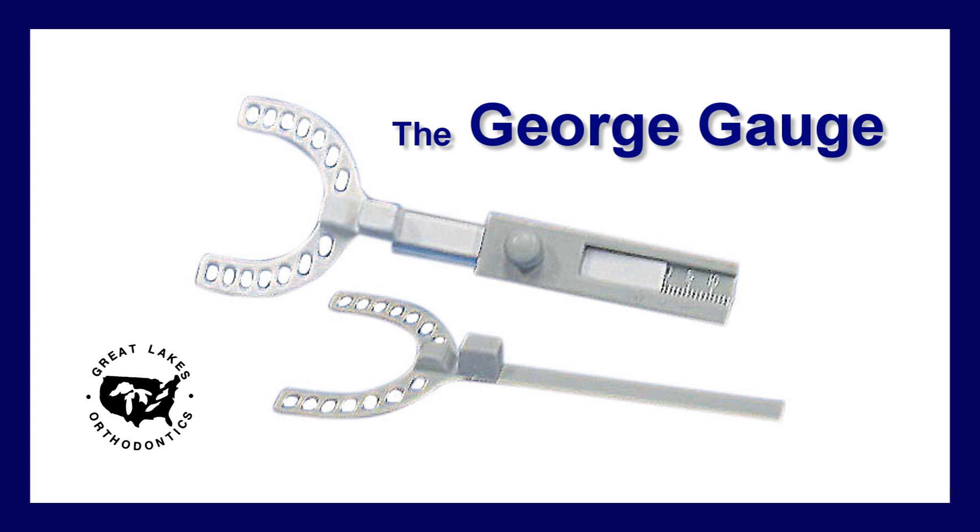This video will demonstrate the use of the George Gauge. The George Gauge is designed to help you capture an effective bite for sleep appliances and for functional mandibular repositioning appliances.